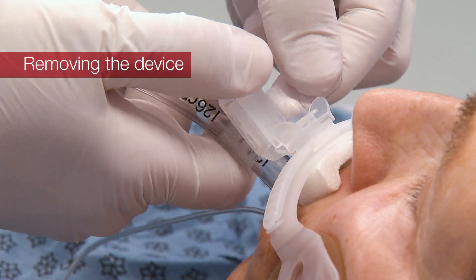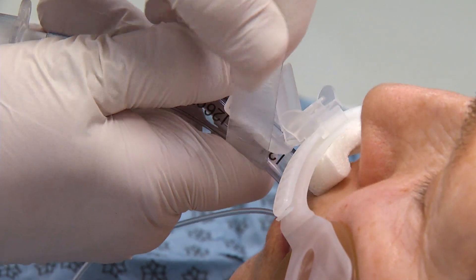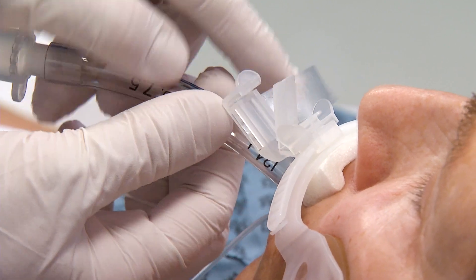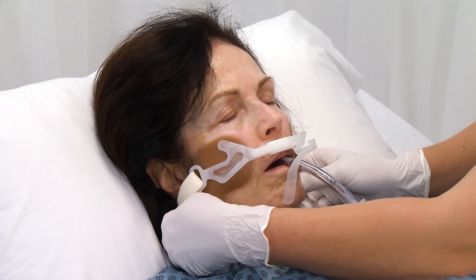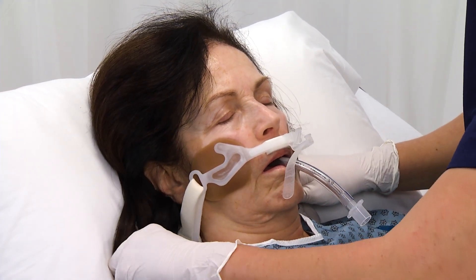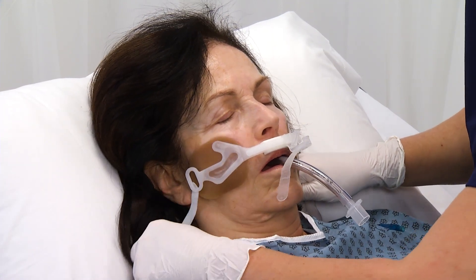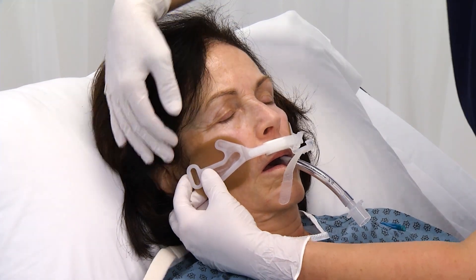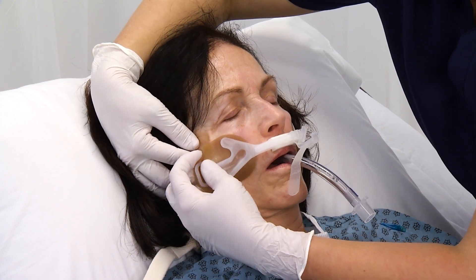Release the security clamp holding the wrap in place. Carefully remove the wrap from around the ET tube. Release the neck strap by unfastening the hook and loop closures. Remove the skin barrier pads by gently peeling them away from the patient's skin.